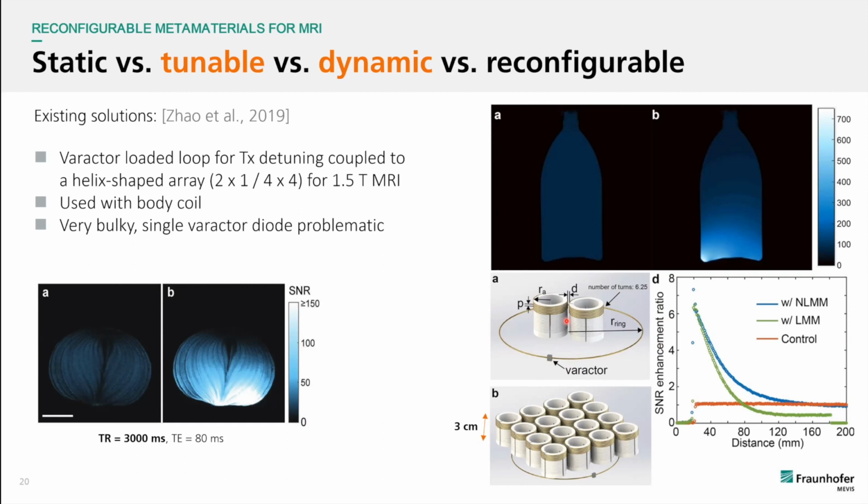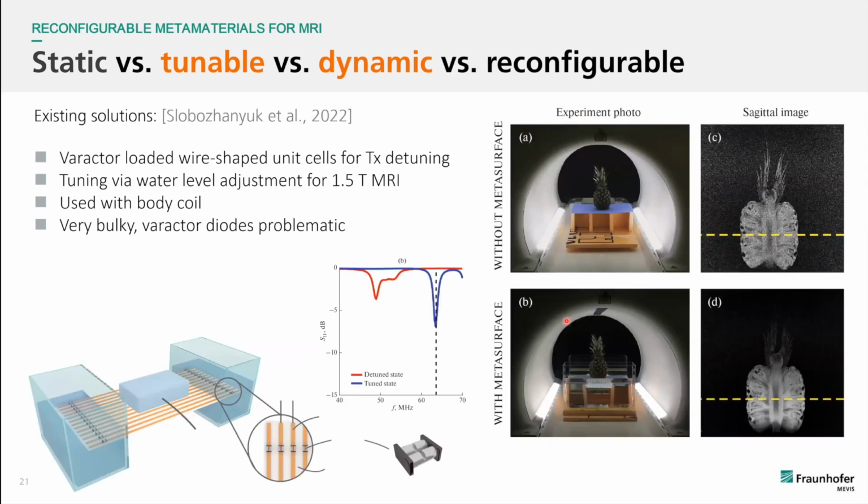They show that it detunes for your transmit field. And there are other groups that combine this with the water tanks again for the tuning, and then the varactor diodes for the detuning during the transmit field application. It's a little bit bulky because in this application, for each resonator, you are adding those varactor diodes. So that's quite complex and quite complicated.